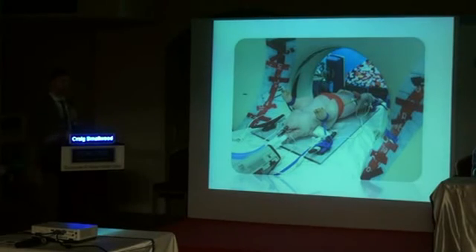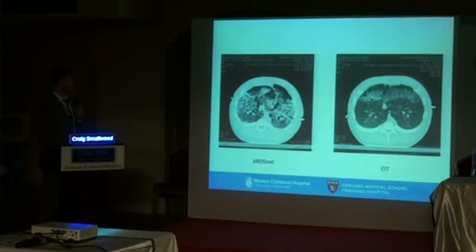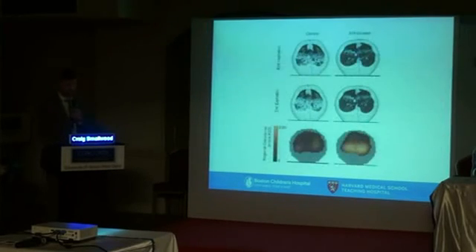So because I kind of told you the convention is with EIT that you have to go to the CT scanner and make sure that your images make sense, because that's just kind of what you do, we took our piglets to the CT scanner, got some images, and here's what we have. So this is a representative image of one of the control subjects who just looks worse, right? I'm not a radiologist, but that looks worse than this. So this was our EIT guided group. So clearly there were important differences in the CT findings.